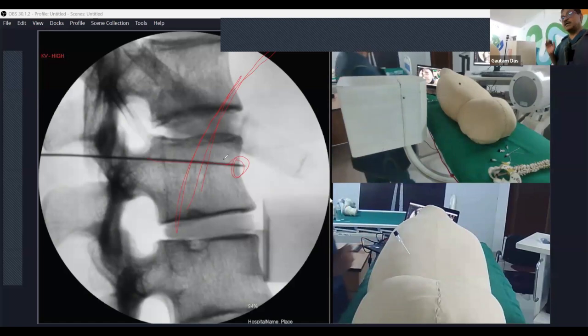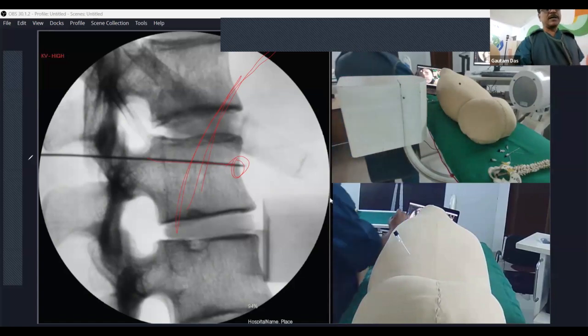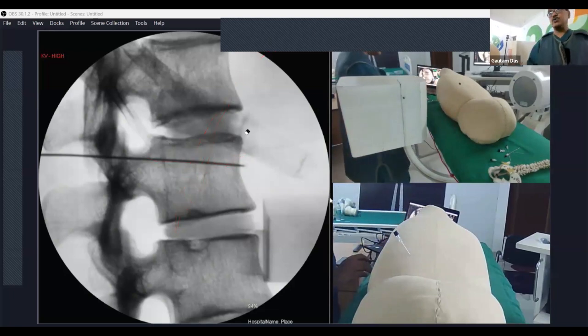Here there are two needles, and the volume of the alcohol will be higher, 20 to 25 ml on either side, so around 40 to 50 ml in total. But for the transaortic approach, only a single needle is enough, and 15 to 20 ml is enough. Because we are bang on target, just around the celiac trunk, the volume of the drug should be less.